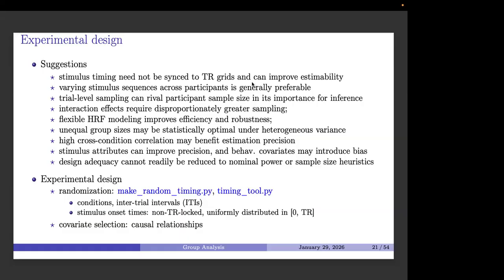Okay, maybe we can take one more question, then we will take a break here. So Farouk is asking about the sample size again, with regards to the number of voxels rather than the number of subjects or trials. So yes, our high resolution interest question. When we acquire higher resolution fMRI, we have 8 times more voxels, let's say. If you double your spatial resolution, you get 8 times as many voxels. How would this affect your HRF modeling? As you move to higher spatial resolution, does that number factor into any of this?